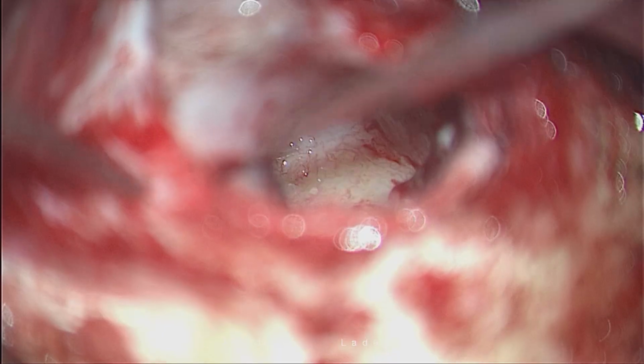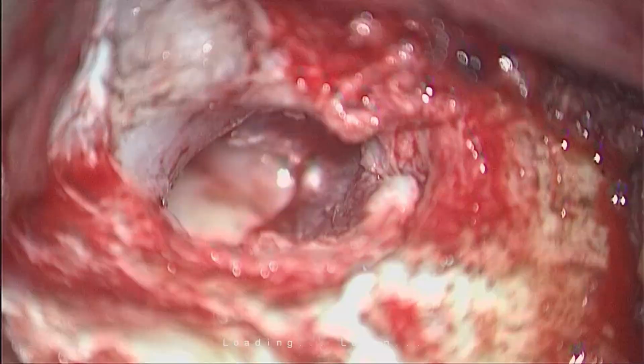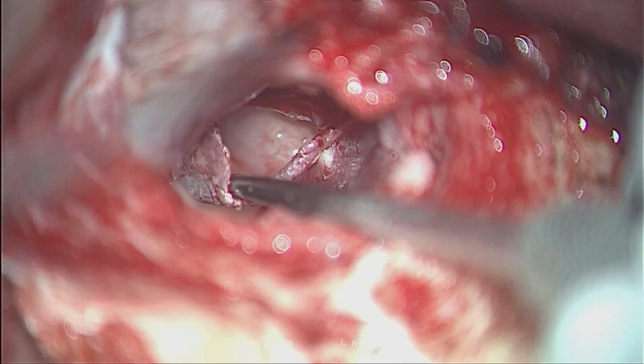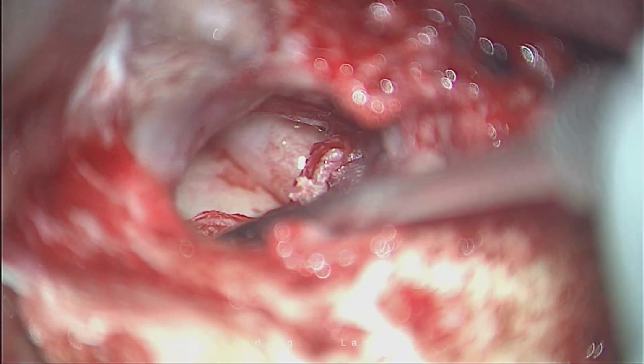But generally we try to avoid doing canalplasty in every case. Now, I have repositioned the tympanomeatal flap back. Can you see? Like it was not elevated at all. Now see, if I elevate, the difference is the mucosal layer is left below, you can see all the way, and the rest of the two layers have been elevated.